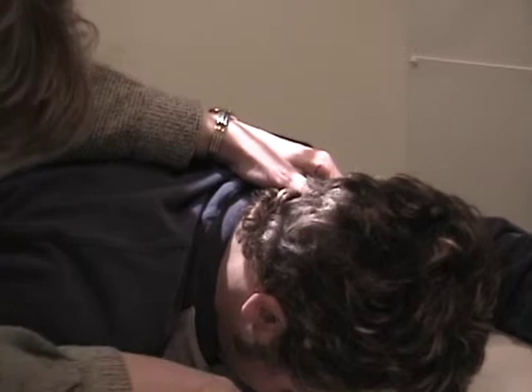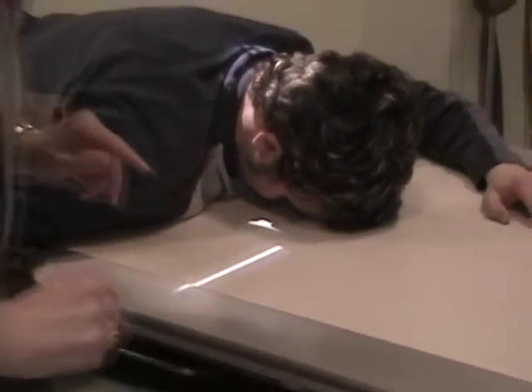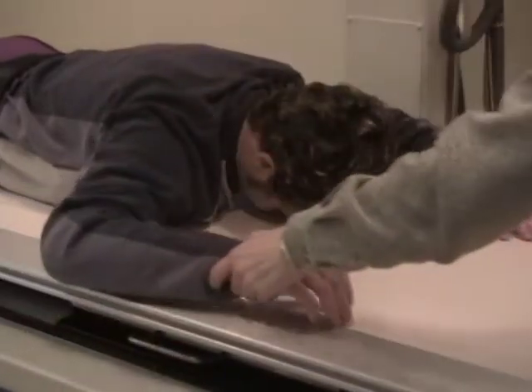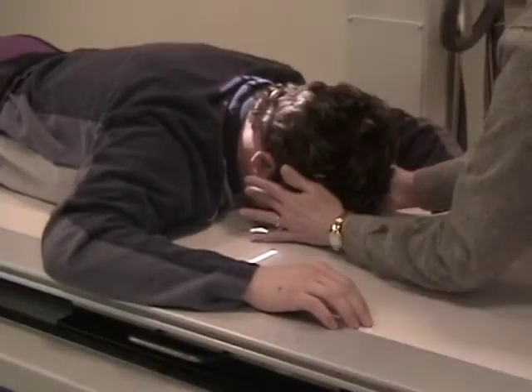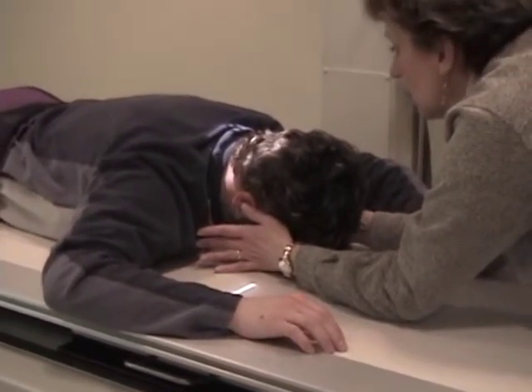You want the central ray to enter approximately 1.5 inches inferior to the inion, and it will be exiting right here approximately 1.5 inches above the nasion. So I'm happy with the centering on this patient, and the last thing I need to do is check the MSP for centering and to make sure that he is truly in a PA position.